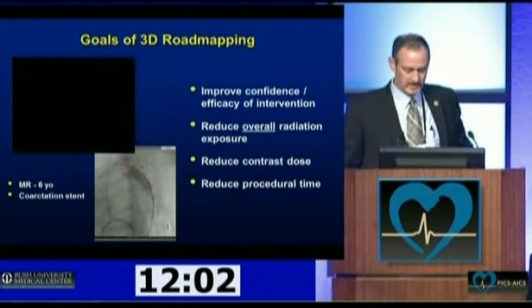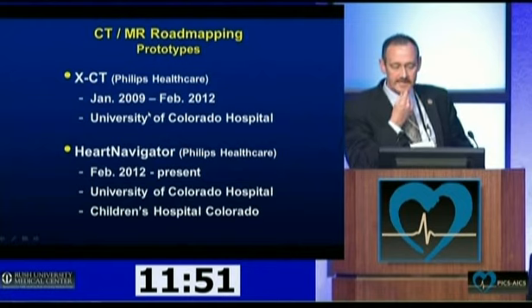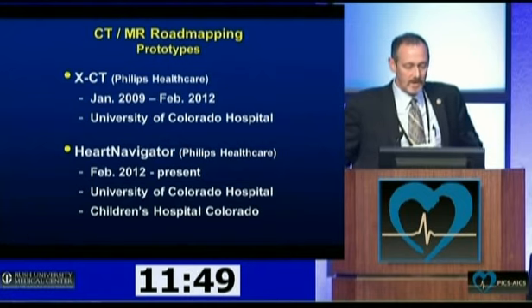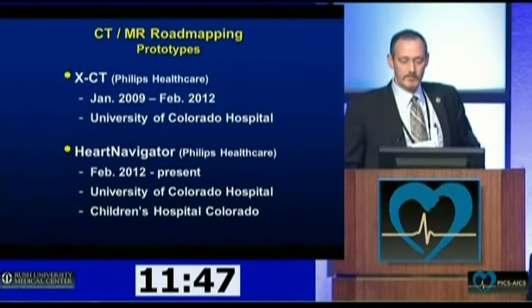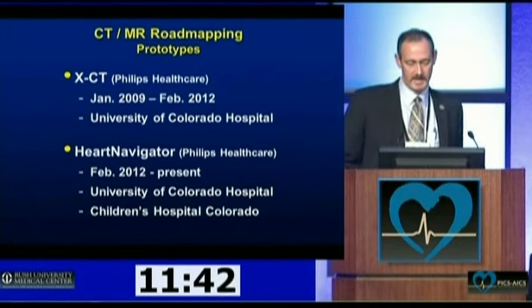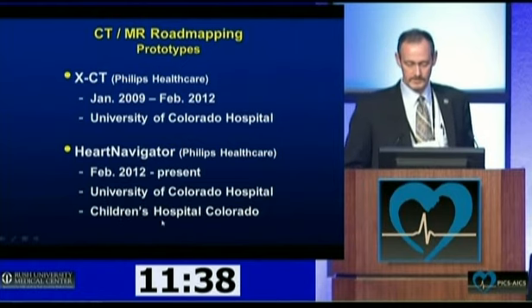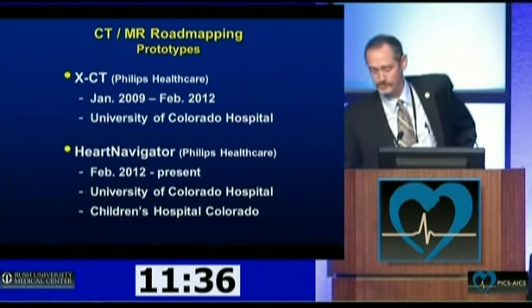The initial prototypes were started at the University of Colorado Hospital, in John Carroll's lab. The system was an XCT format. However, in February, a newer prototype became available to us, called Heart Navigator, and that was available at both of our institutions, University of Colorado and Children's Hospital.